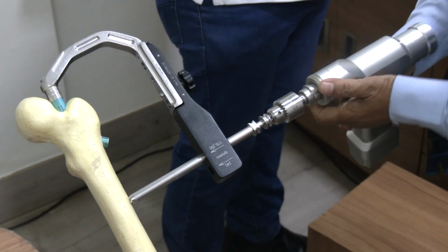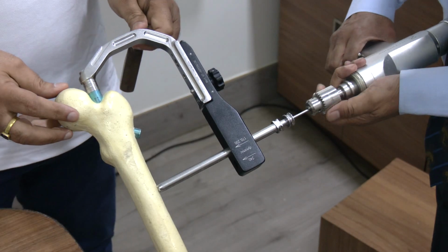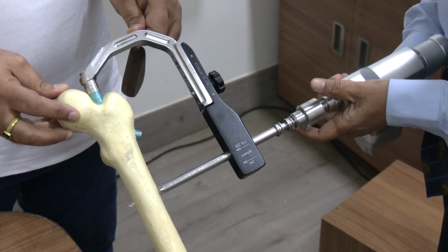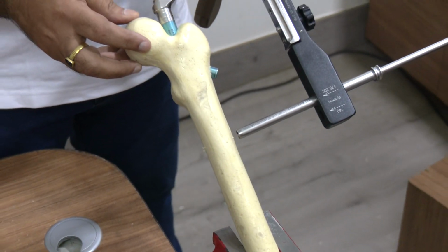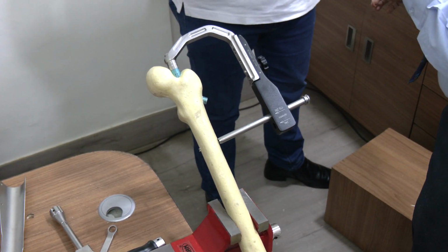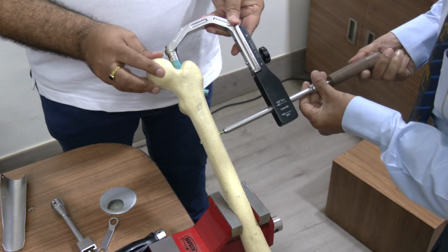Okay, so the length is a little less. So I have done the drilling. Now I'll pass the bolt. So this is the bolt we have selected. Probably this will be a little shorter, but anyway, that's okay.